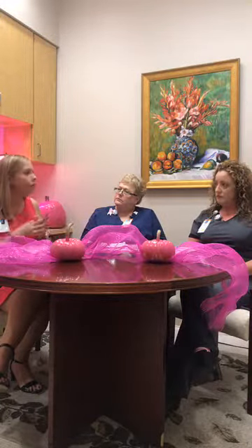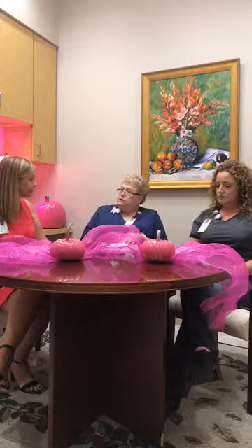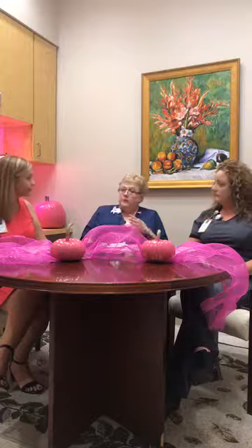After you've had your mammogram, how long does it normally take before you would get your results? Well, one thing that we do as navigators, as the nurses, is that on a daily basis we check all the mammograms that have been done the day before. You give the radiologist at least 24 hours to have read them. And we go through that and pick out anything that has been flagged as an abnormality. What we look for is something called BIRADS, and they go from 0 to 6. A 4, a 5, or a 0 means something has been detected that might be abnormal. Doesn't mean it is, but there's something that needs further testing done.